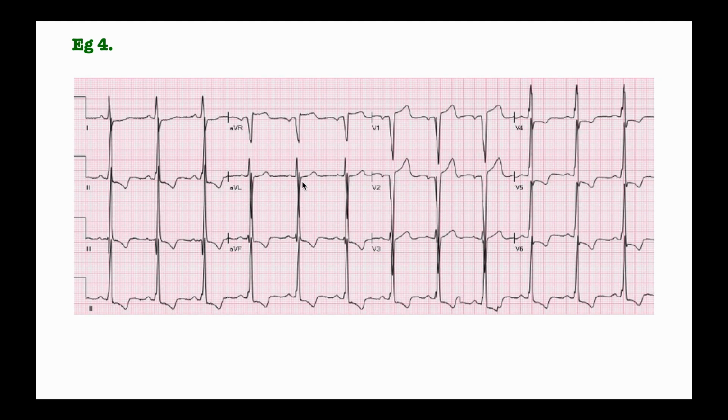And also on this one, let's do more. Over here you can see we can use either V5 or V6. So we can count. Let's start from here and count 5, 10, 15, 20, 25, 30. So over here, V5, we are getting 30. Let's go to V1. So we have 5, 10, 15, 20.